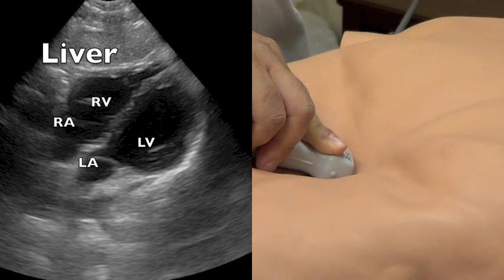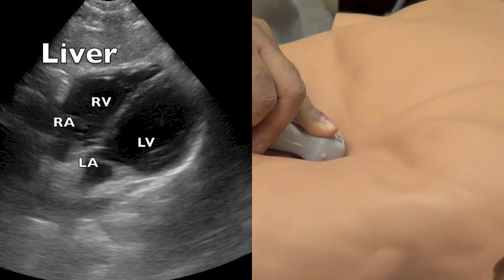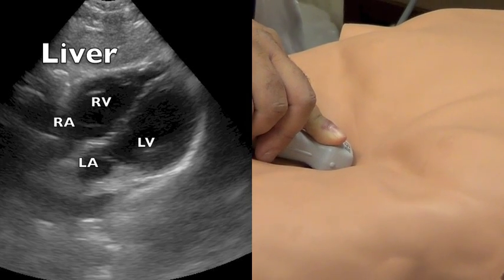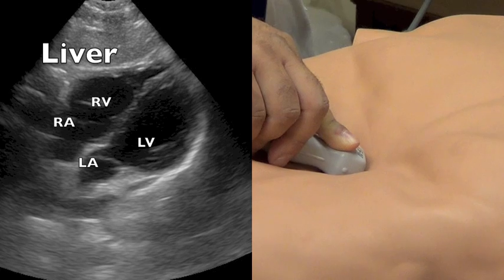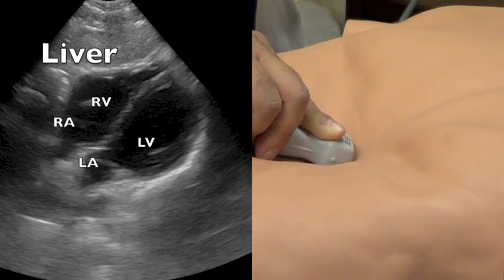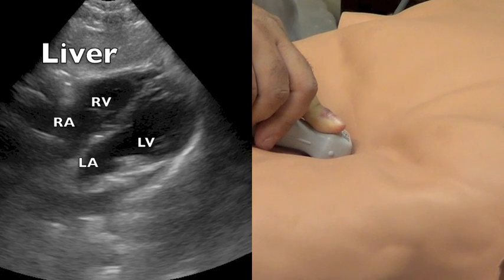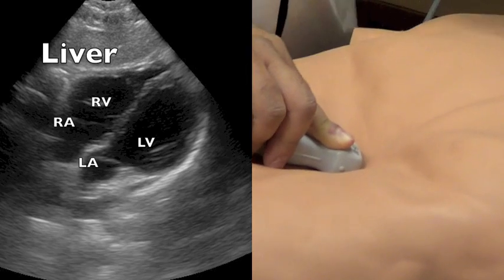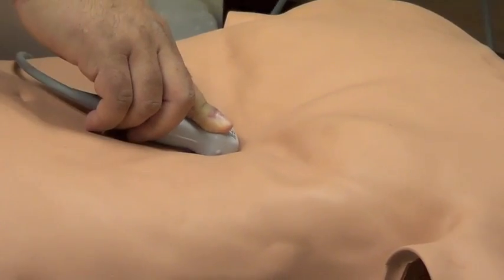In that view, you should be able to see the liver. The right side of the heart would be on the top portion of your screen — you're going to see the right ventricle and the right atrium. On the lower portion of your screen, you should be able to see the left ventricle and the left atrium. You should have a good depth so you can visualize the whole pericardium.